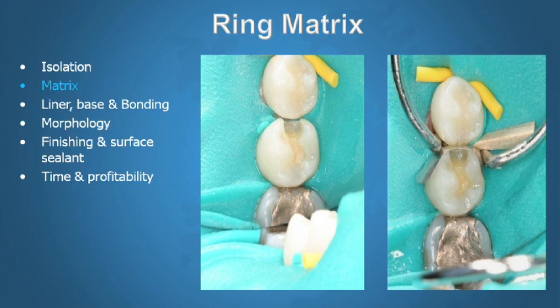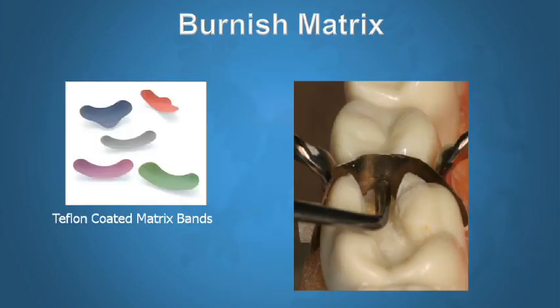one desirable thing to remember is that if your adjacent tooth is a little uneven, don't ever hesitate to pass your Softflex disc and flatten it a little bit, and get your adjacent tooth to have a decent shape before you place your ring.